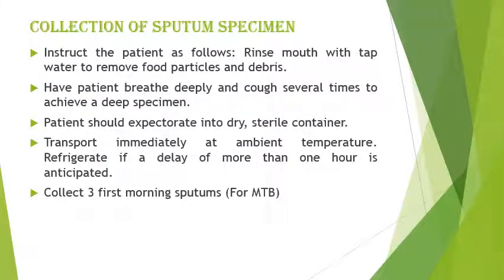Okay. Next would be collection. How do you collect a sputum specimen? Instruct the patient to rinse the mouth with water to remove food particles or debris. But sometimes, we do not instruct tap water. We ask them to use distilled water because in tap water, you can actually have non-tuberculous mycobacteria organisms. Note, have the patient take a deep breath and cough several times to achieve the deep specimen. We need the deep specimen or the sputum sample and not salivary.